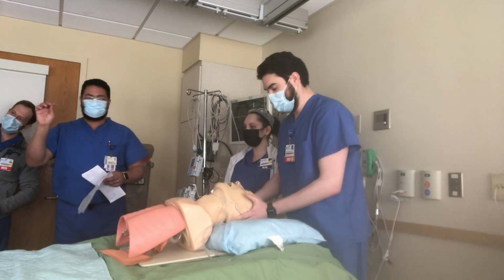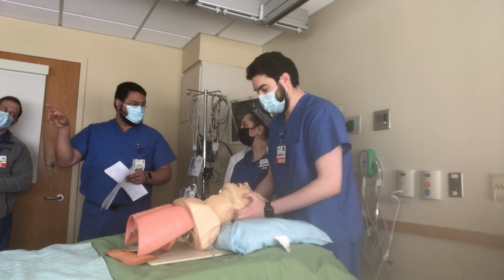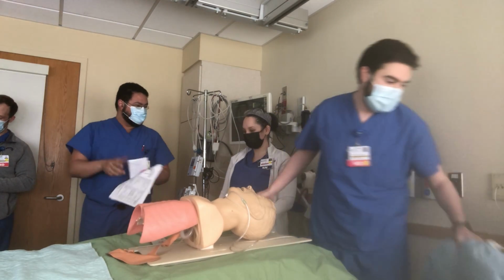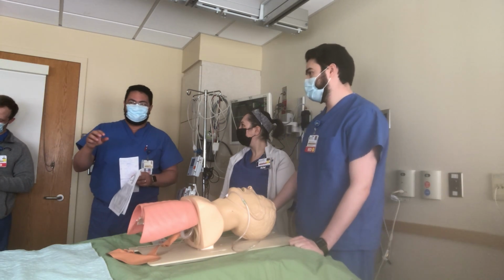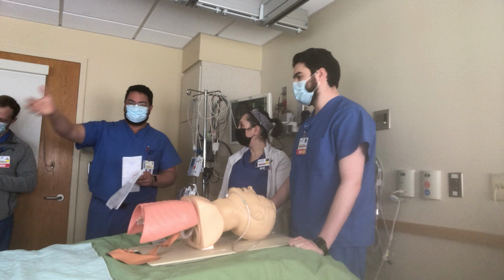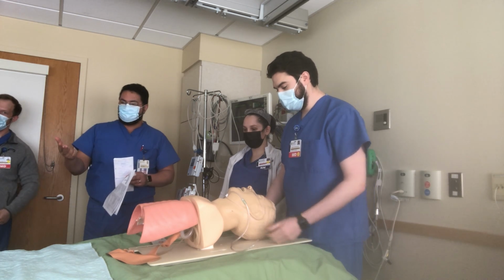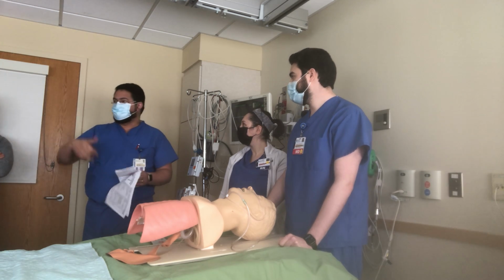Can I just summarize the stuff in one word? Miss Madman. Remember me, I'm the madman, and he was the miss. So Miss Madman: M is for machine, so the respirator is bringing the machine. S is for suction. The other M is for method. So you have to have another method available.